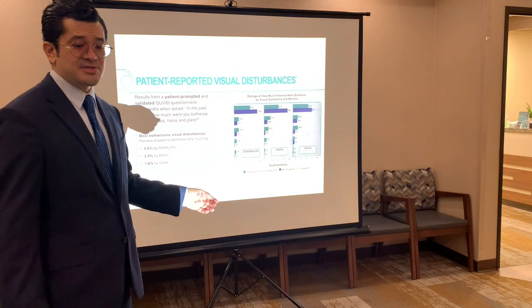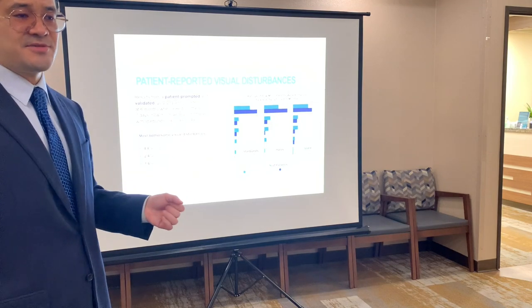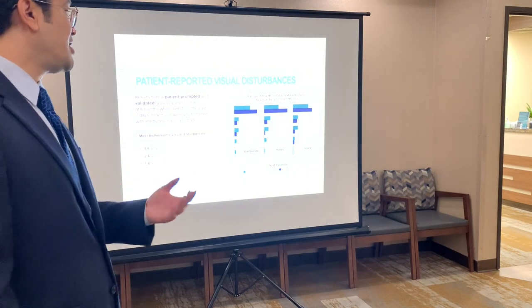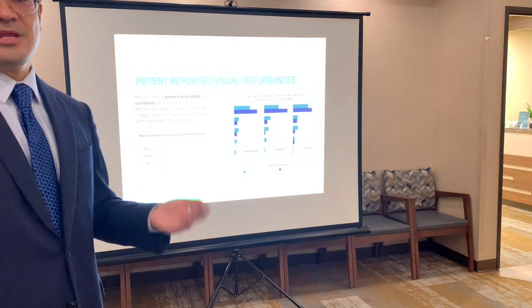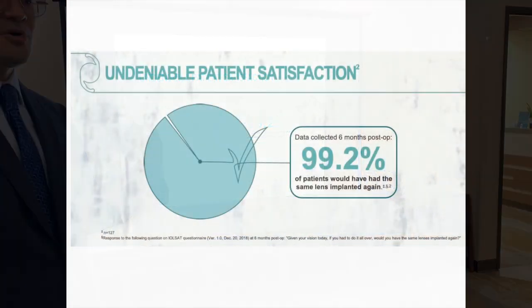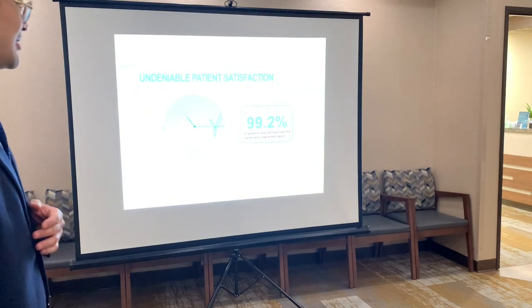There's side effects with the multifocal lenses. In order to get those zones of focus into focus, we are going to have more side effects. We have starbursts, halos. We always warn a lot of people about halo effects, but that's for many people with these multifocal lenses, especially at night. So overall, most people like it, but there's still that 1% who just don't do well on that lens.